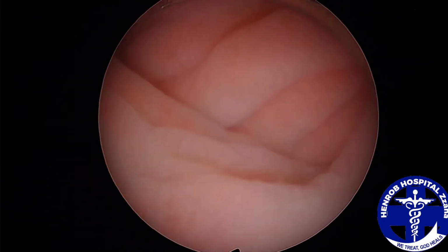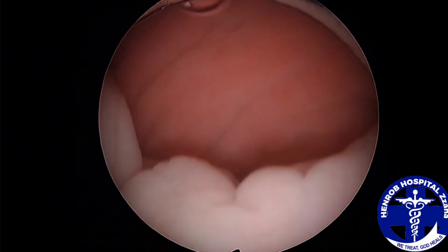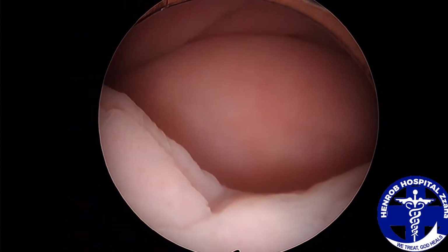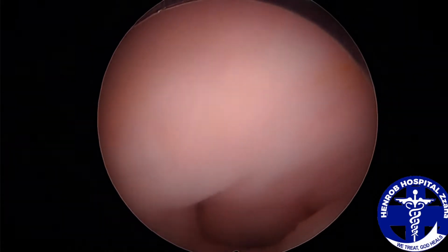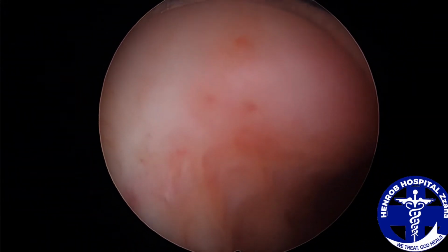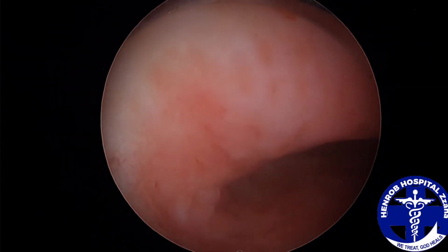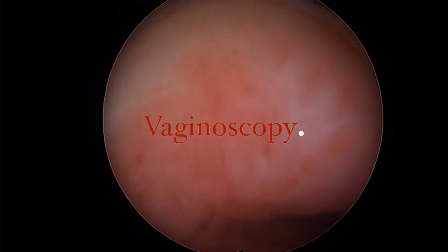As you can see, in conclusion, it is clear that hysteroscopy has a role to play in the evaluation of missed abortions, especially below 6 weeks, both morphological and cytogenetic evaluation. And it also helps us to avoid complications associated with blunt curettage, like synechia.